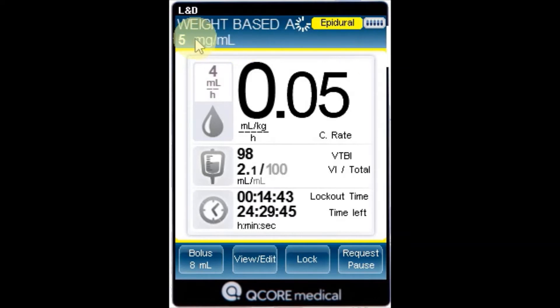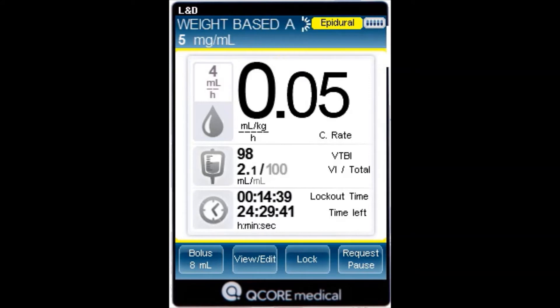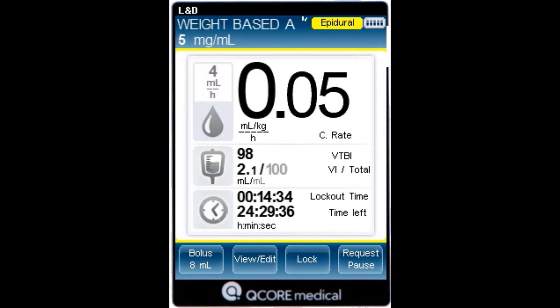Drug name: the name of the drug is displayed on the indicator bar when working with the drug library. Drug concentration: the drug concentration, as entered by the user — final concentration or drug amount over diluent volume — is displayed when applicable.